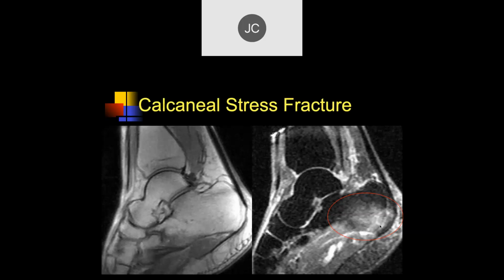And this is another calcaneal stress fracture. This is a more common location, and this is typically due to impaction injury rather than traction injury like the last one. And so this is one of the more reasonably common causes of heel pain. And again, this is due to that heel strike, which you get with shoes on that you don't get when you run without shoes on, typically.